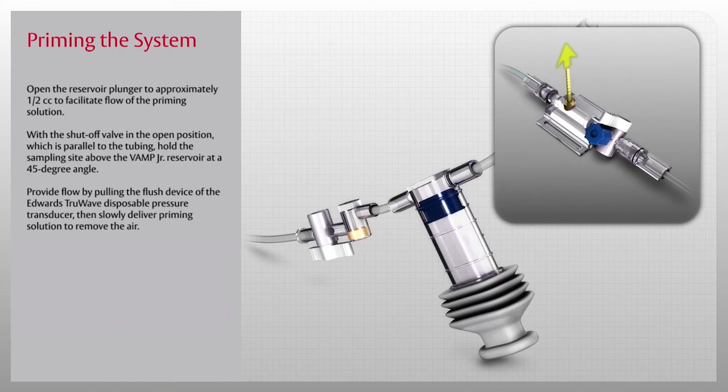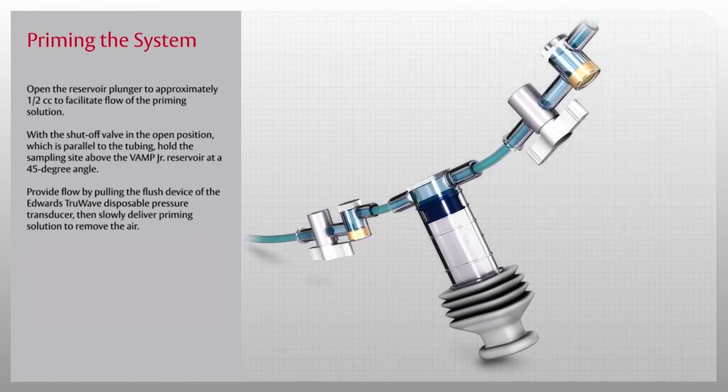Now, provide flow by pulling the flush device of the Edwards TrueWave disposable pressure transducer. Then slowly deliver priming solution to remove the air.